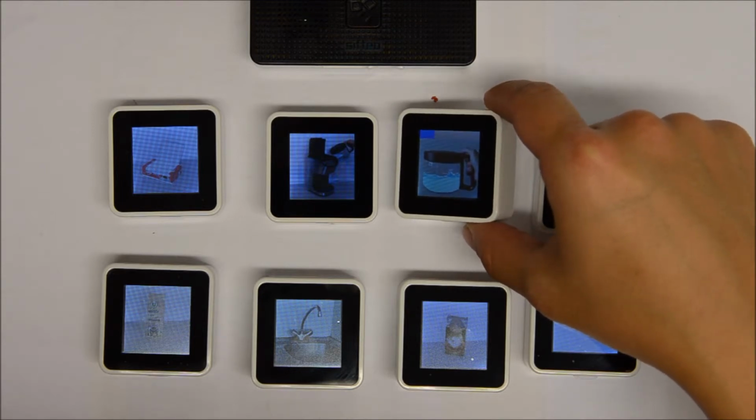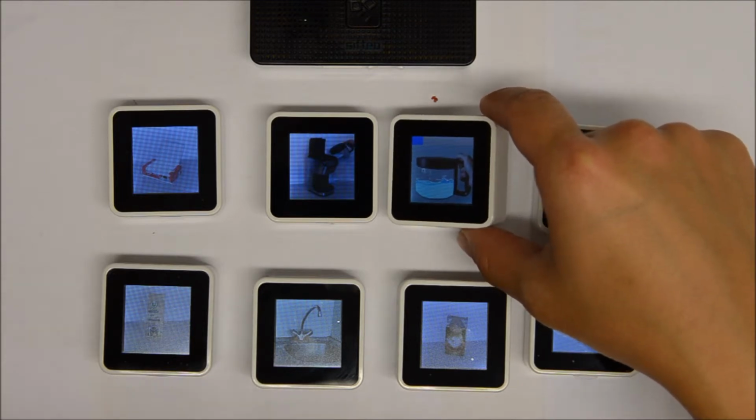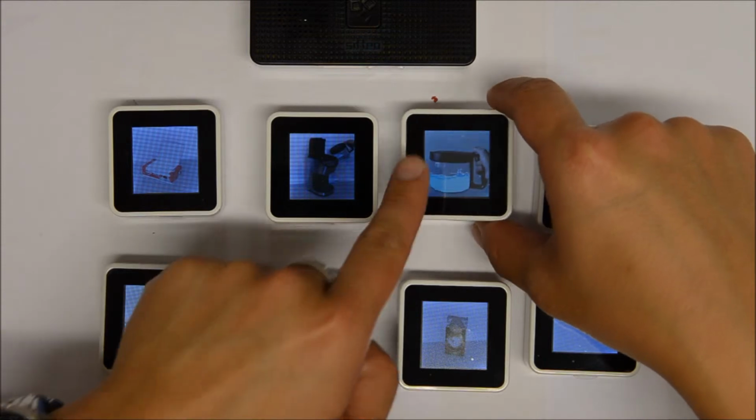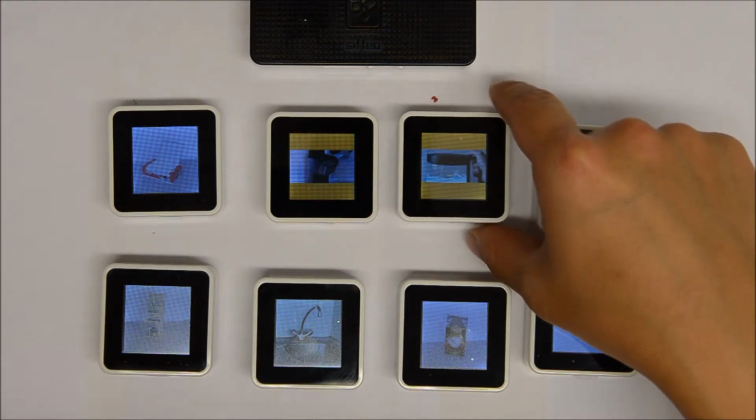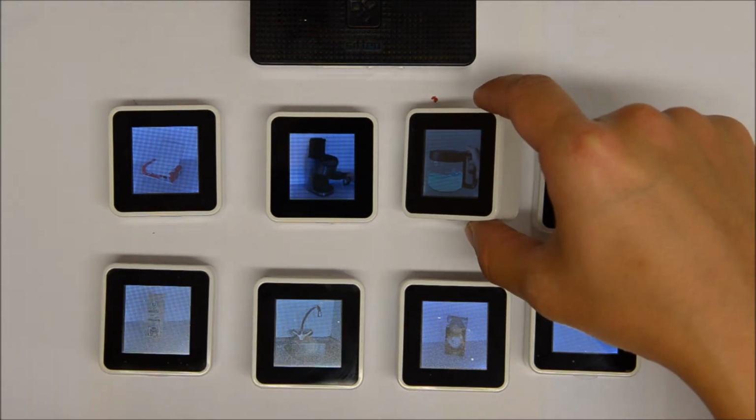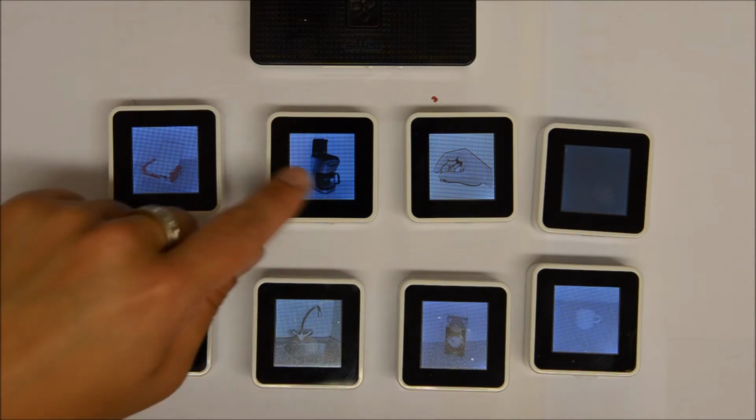and hold that for 2 seconds. As you can see, there are 2 progress animations here. We have the progress bar on the top. That's the second level reminder coming up. Progress bar on the top, and then little animations on the main screen. Now we're finished with the task. A little bit of sound effects as well.